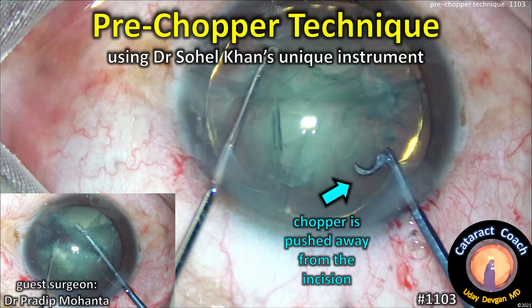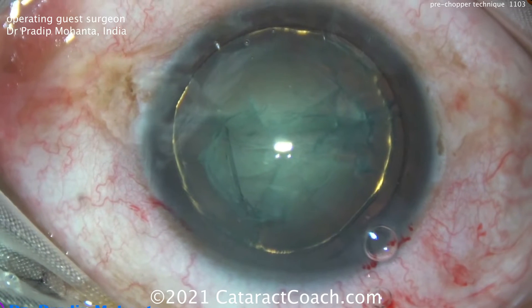CataractCoach.com — pre-chopper technique using Sohail Khan's unique instrument. Our guest surgeon is Dr. Pradeep Mohanta from West Bengal, India.